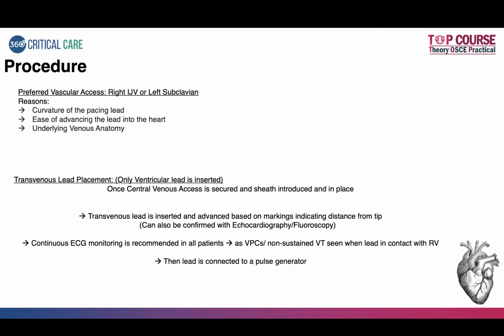And usually the newer generation leads have a balloon tip catheter to prevent any kind of trauma to the endocardium. That can be advanced based on the markings indicating the distance from the tip, or it can be confirmed via echo or fluoroscopy.